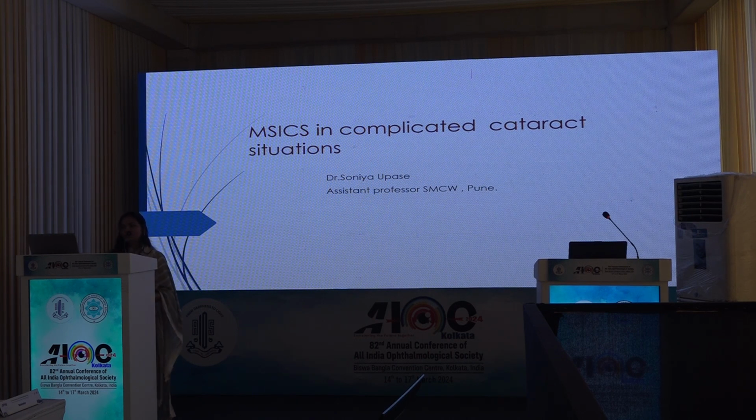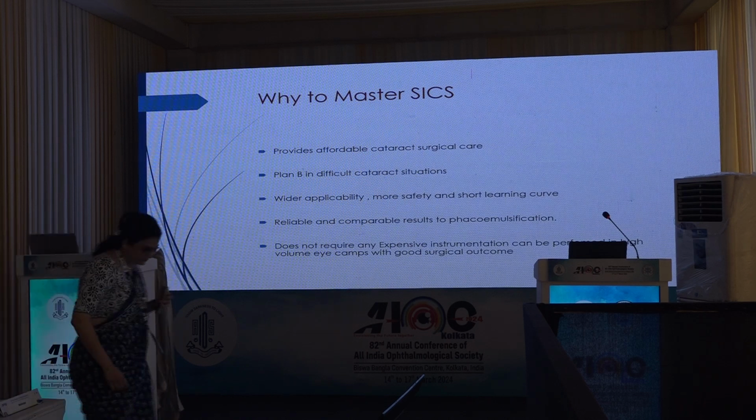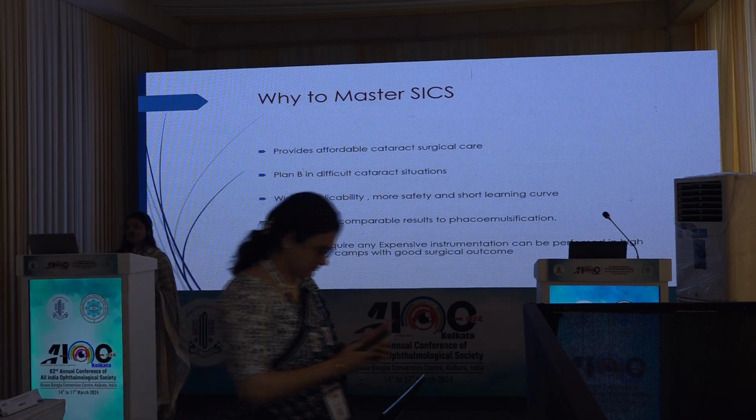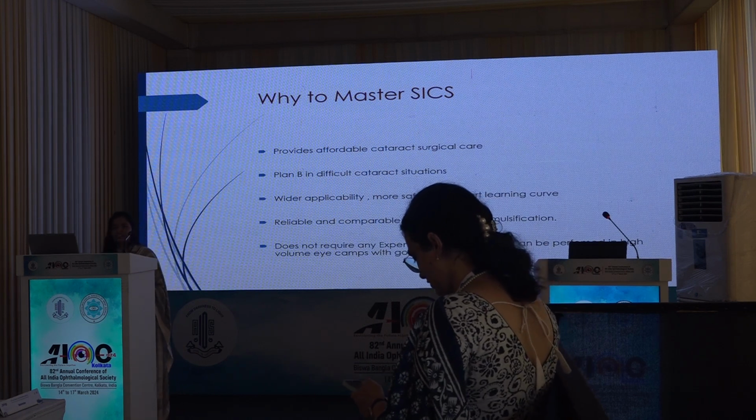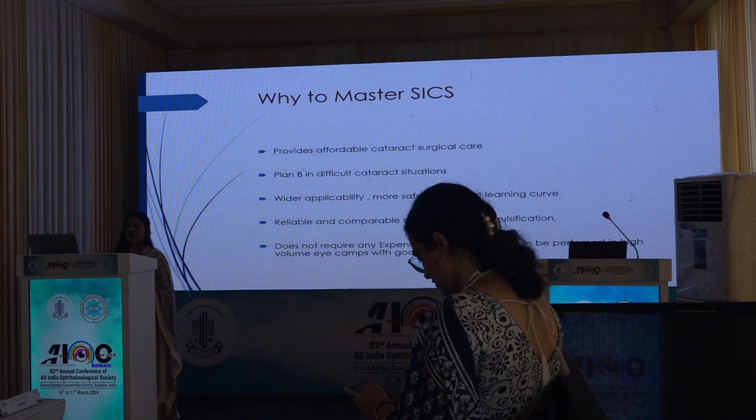My two topics today are very simple, yet they are very important regarding the surgical outcome. My first topic is manual small incision cataract surgery in complicated cataract situations. So in the era of femtosecond cataract surgeries, why should we learn and master small incision cataract extraction surgeries? Because there are many good reasons.